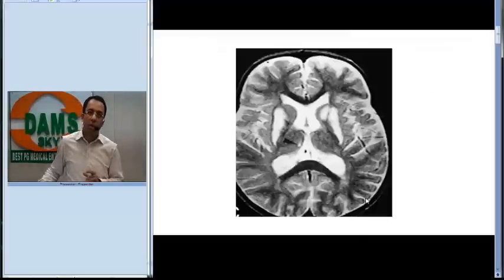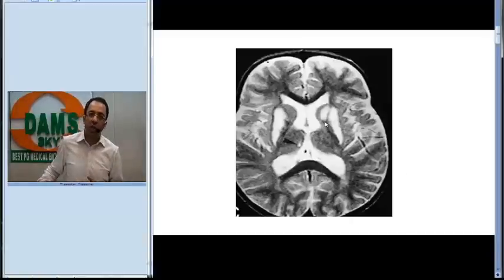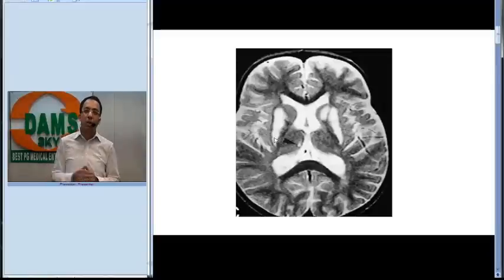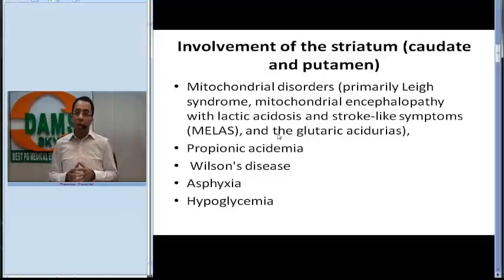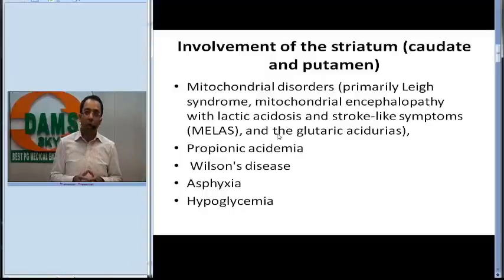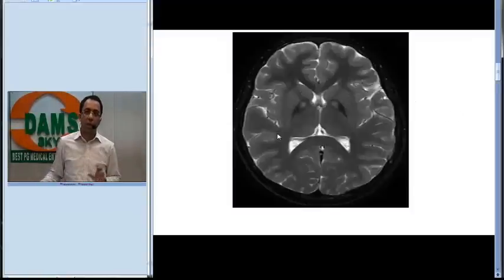We also look for deep gray matter involvement in gray matter disease. Looking at the first image, in this gray matter disorder you can see involvement of the striatum — specifically the caudate nucleus and the putamen. Whenever we see involvement of the striatum, we think of disorders like mitochondrial disorders such as Leigh's syndrome, MELAS, glutaric aciduria, propionic acidemia, Wilson's disease, asphyxia, and hypoglycemia.